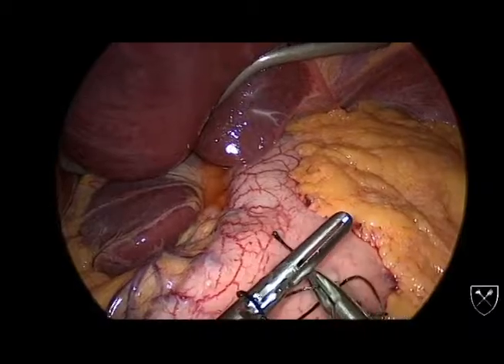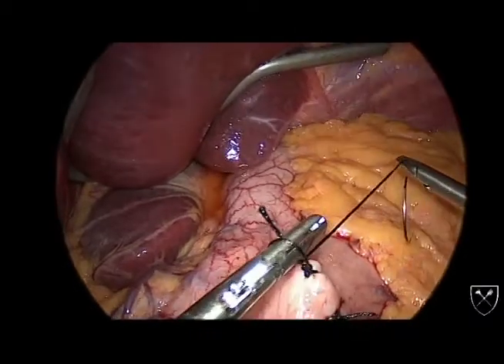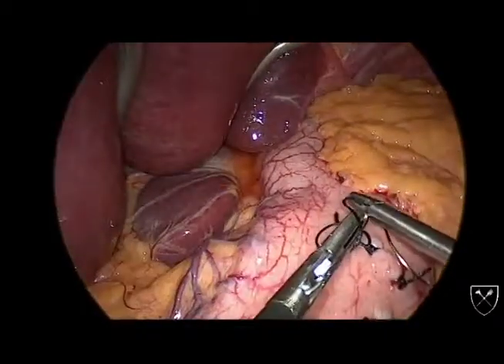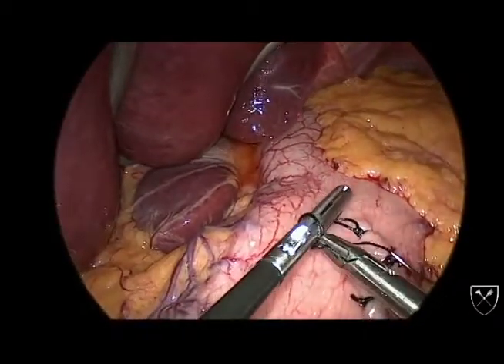How the grasper holds the tail is also important, especially when the suture is short. If you randomly pick up the tail so that it looks like a T in the middle of your grasper, it will be difficult to get the loop to fall off the grasper.